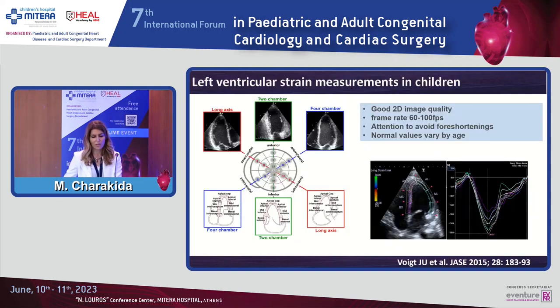Now, moving on to children, where we can apply the speckle tracking, we can measure the left ventricular strain. In some studies they report the 6-segment method just on the 4-chamber view, and the circumferential and radial strain at the level of the papillary muscle, but of course we can report the 17 and 18-segment method by obtaining speckle tracking in the 4, 2, and 3-chamber views.